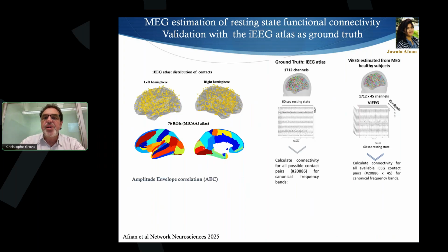So what are the main metrics? Usually to compare the link between 2 regions, we can be based on amplitude, notably we can filter in a specific frequency band and correlate the amplitude. This is amplitude envelope correlation. Or we can look at the phase, like the phase locking value.